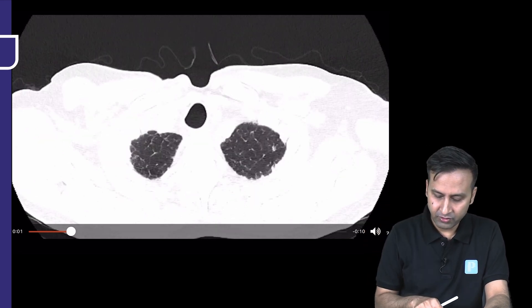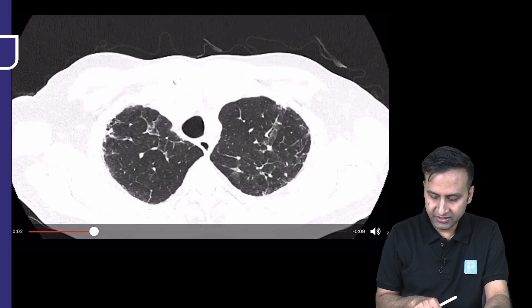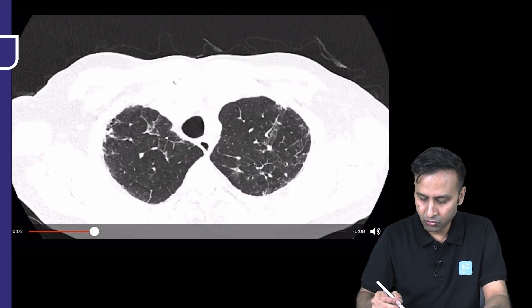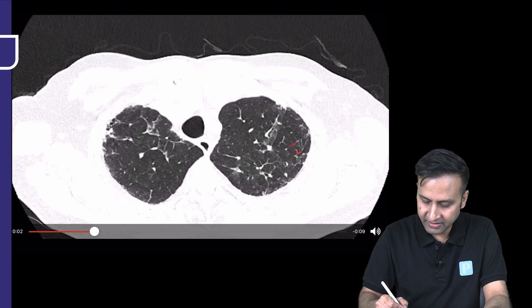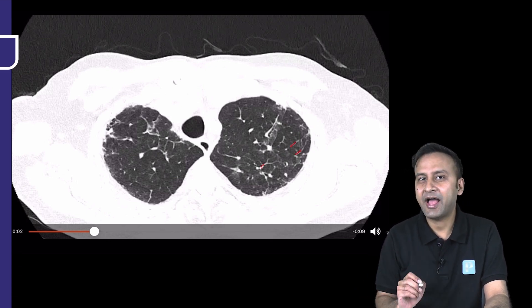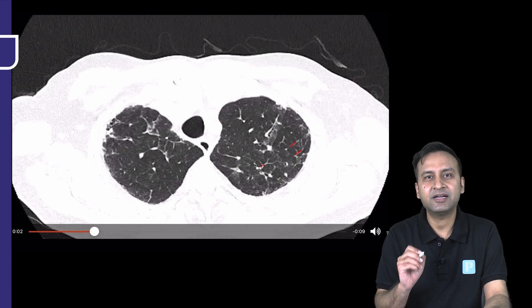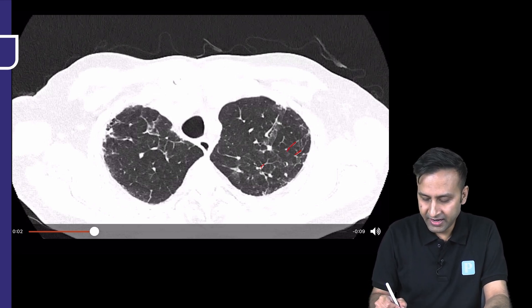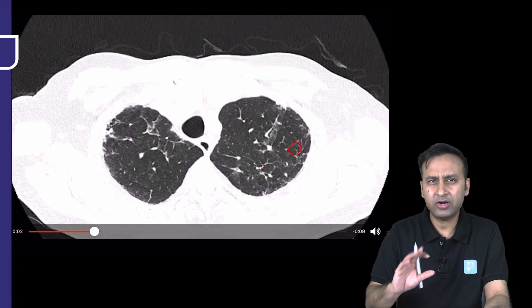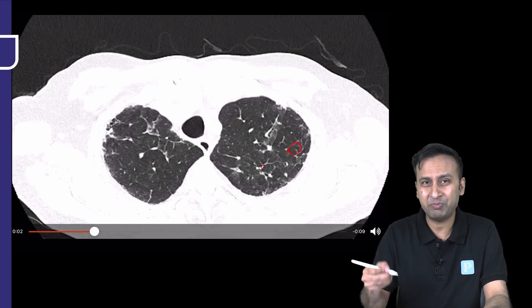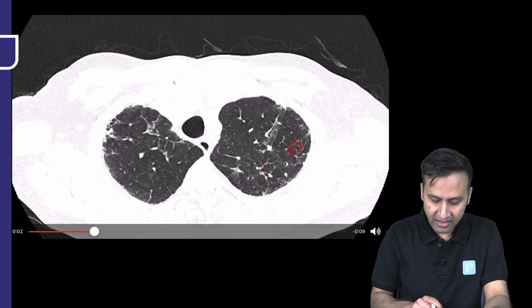Looking from the top, it is very easy to identify that there is an excessive number of lines in this image. There are lines located in the lung parenchyma everywhere, so we do have a reticular pattern. This reticular pattern is taking the shape of interlobular septal thickening because it is more hexagonal. Intralobular septal thickening will be much finer — it will be lace-like or net-like.